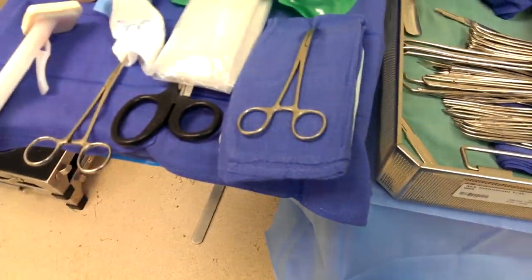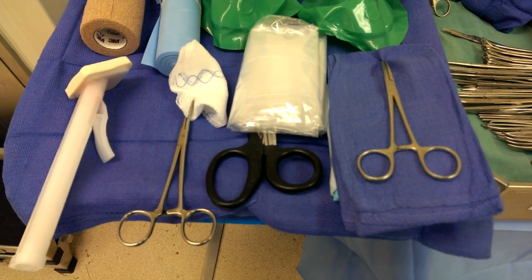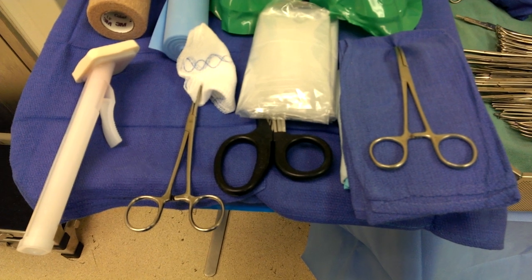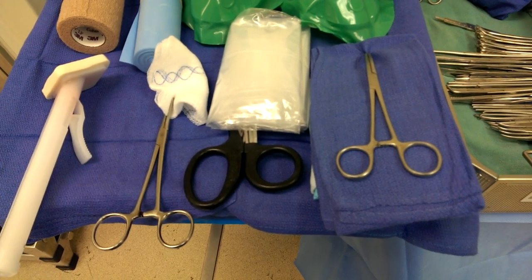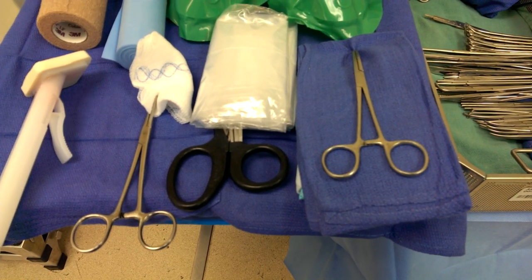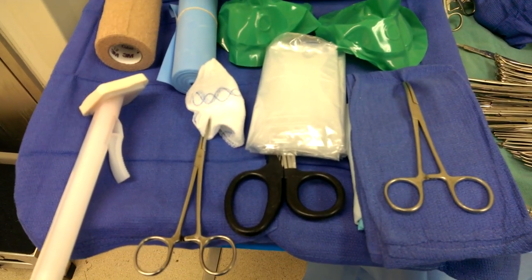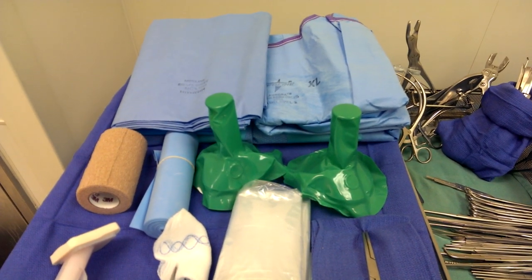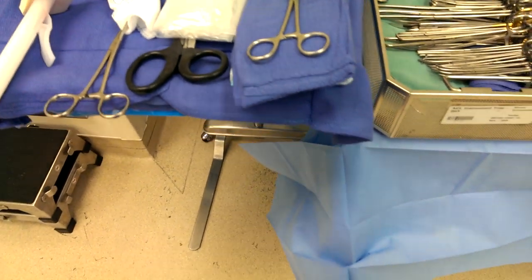Moving on to my draping — I have my drapes ready. If they're going to hang by the toes, I have my Coban sponge, prep stick, scissors, clamp with a towel, and the stockinette. We use co-band here; other places use ace bandages or whatever. And I have light handles, the surgeon's gown and gloves. And basically that's it.